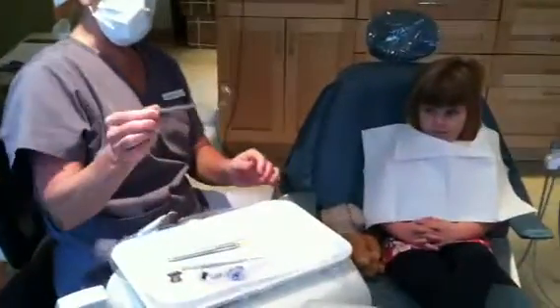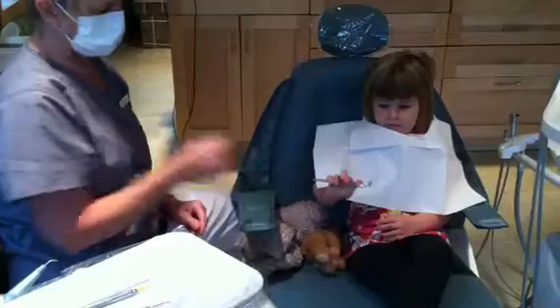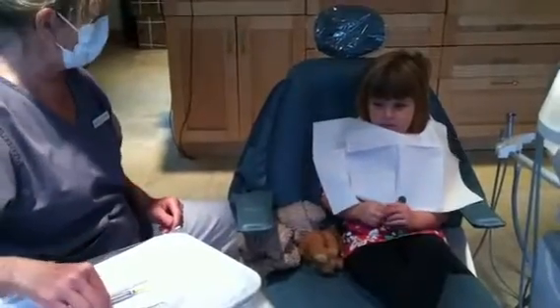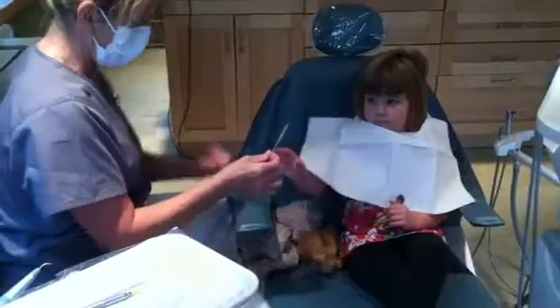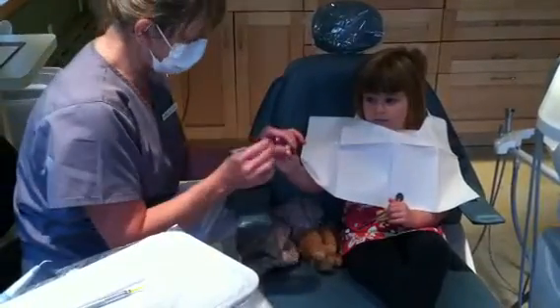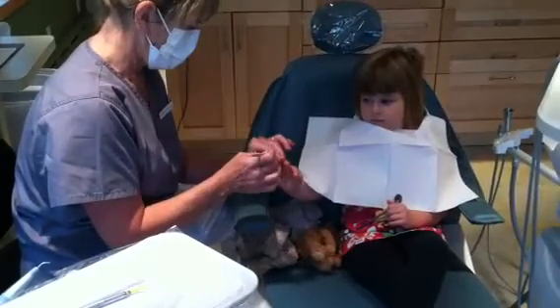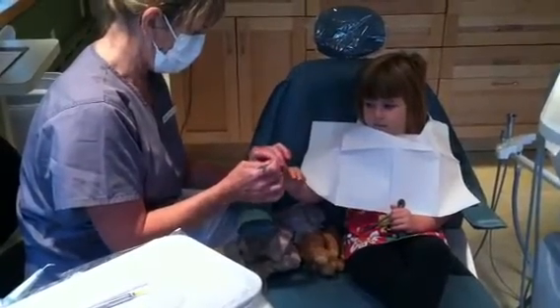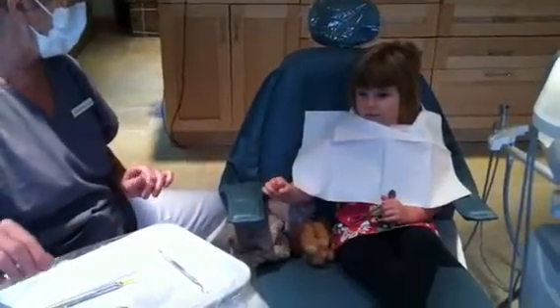So this is my mirror — you can hold it. That's so I can look at your teeth. This is my tooth counter, so I'm going to do this with your teeth. We're going to go one, two, three, four. We're going to find out how many teeth you have.